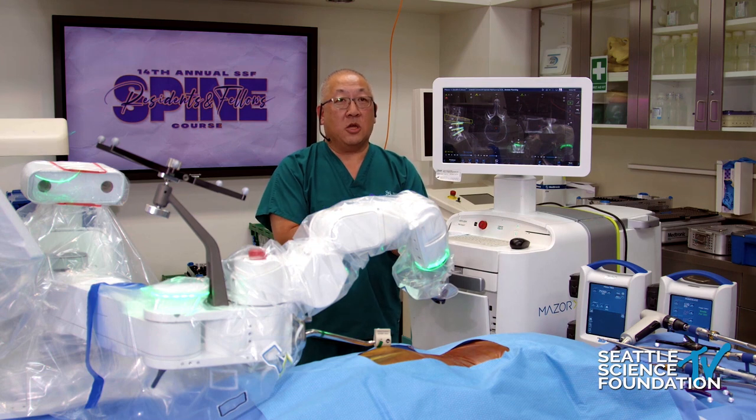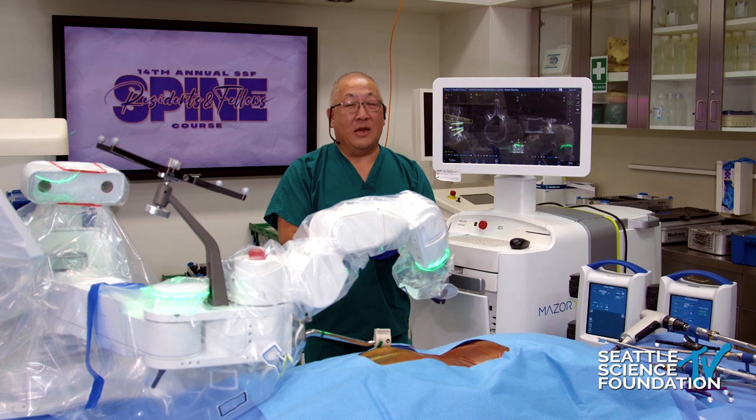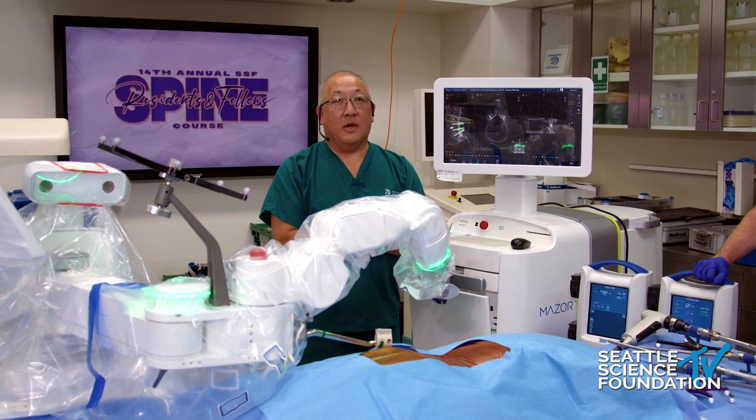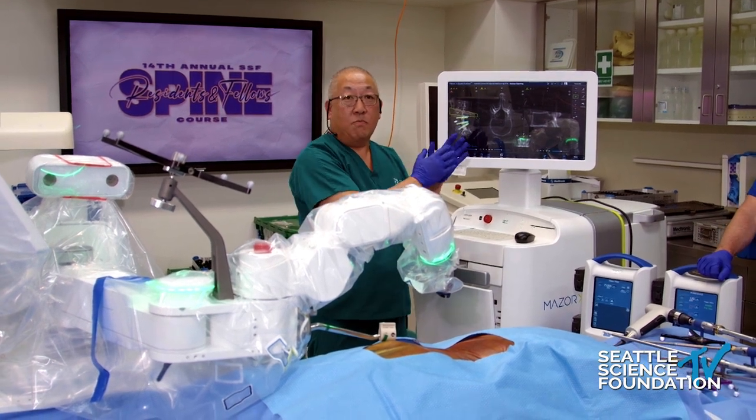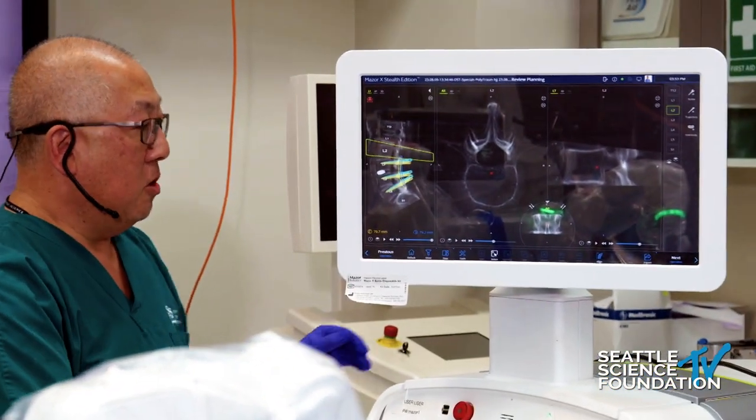It was a really good question earlier in my talk about what's the big deal about using a robot versus adding it to navigation. So I want to go to the computer screen and we'll try to zoom in so we can show a little bit about the computer planning.